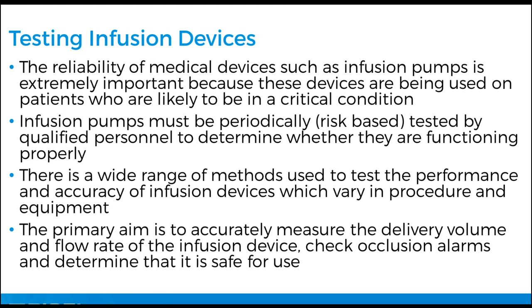Testing infusion devices. The reliability of medical devices such as infusion pumps is extremely important. We all know this because these devices are used on patients who are likely to be in a critical condition. Infusion pumps must be periodically tested. As I said earlier, this is risk-based, but more critically tested by qualified, competent, informed personnel to determine whether they function correctly, are fit for purpose, and meet manufacturer's specifications.